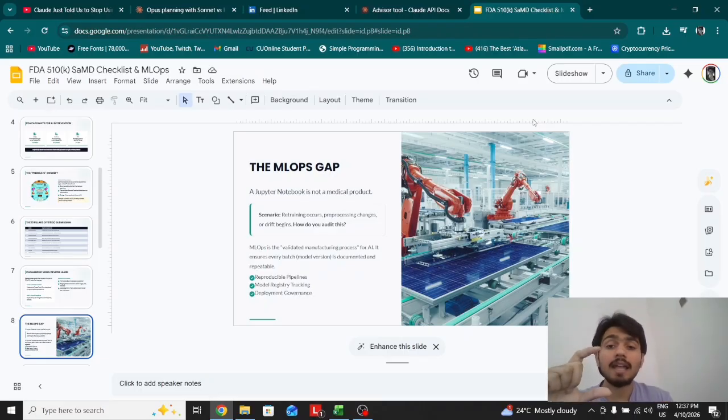Now I cannot just simply, this was my V1 and now I went from 85% to 87%. Obviously 87 is better. I cannot just take all those devices from the market that were performing at 85% and swap them with 87%. That is very wrong. You cannot do this. Nobody does this. So how do we go from version 1 to version 2?